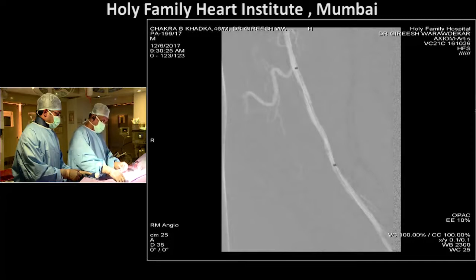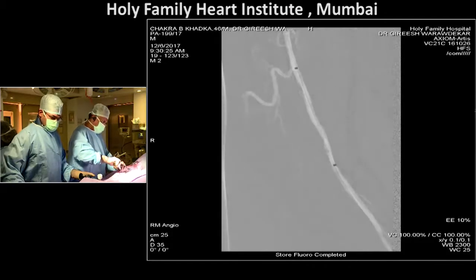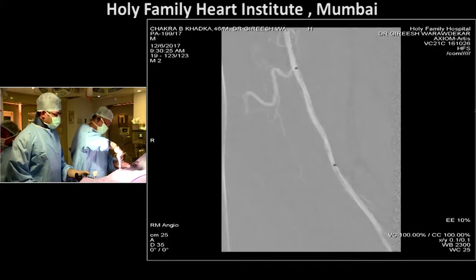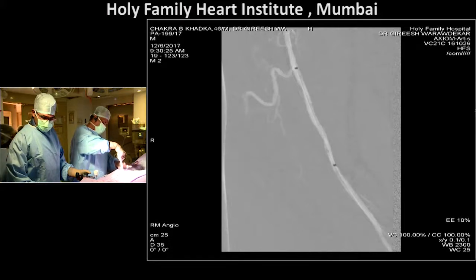Aspiration, as he suggested, is a good choice when you go down there. Maybe a 6 French long guiding sheath, which is often difficult to get, but if you have a 150, a 125 catheter, then you can come from there, or you use these coronary aspiration export catheters to do aspirations there. We often do that in the tibial and in the leg, where we go into the plantar arches and open up those arteries. Yes, Gireesh, so this is your segment that you want to dilate.